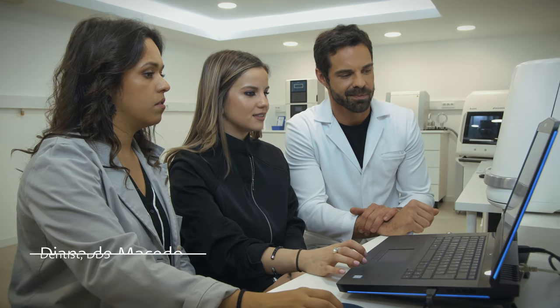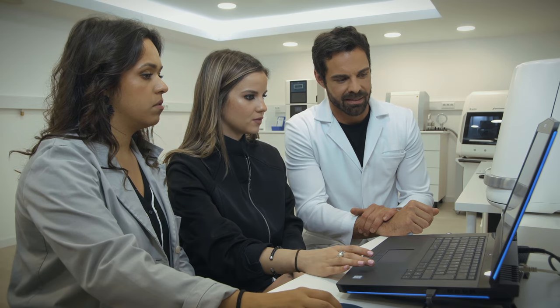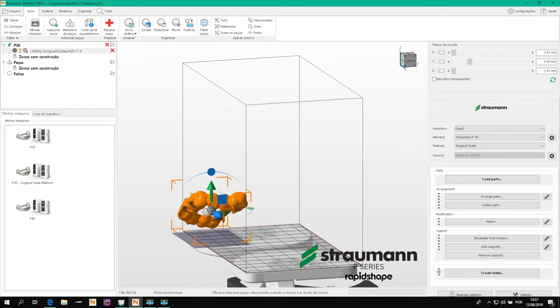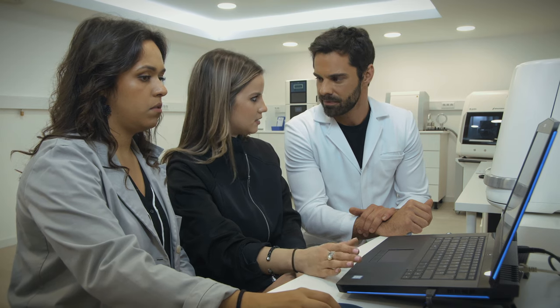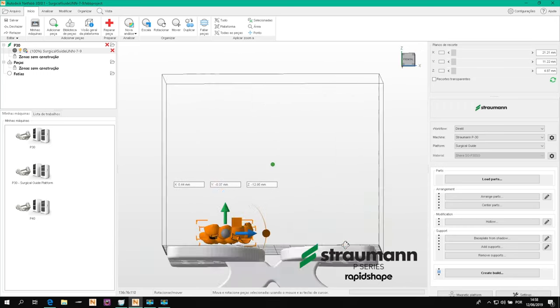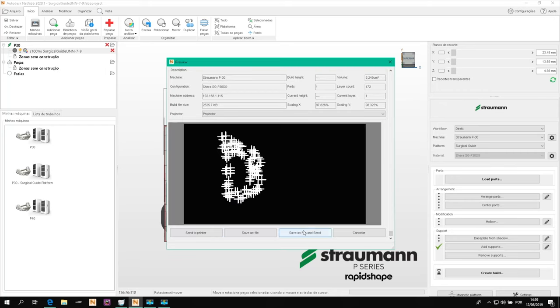So now that we designed the guides, we have to place them in our virtual printer. Of course, send the file in order to have the guide for the surgery. Yes, we have to place it correctly. In this case, it's only one. It can be 2 at the same time, because it's horizontally placed. And then after placing it? After placing it, Jessica will insert the sleeves so we can use it correctly. So now let's transfer the file to the USB, so Jessica can put it in the printer. Let's go, let's print.